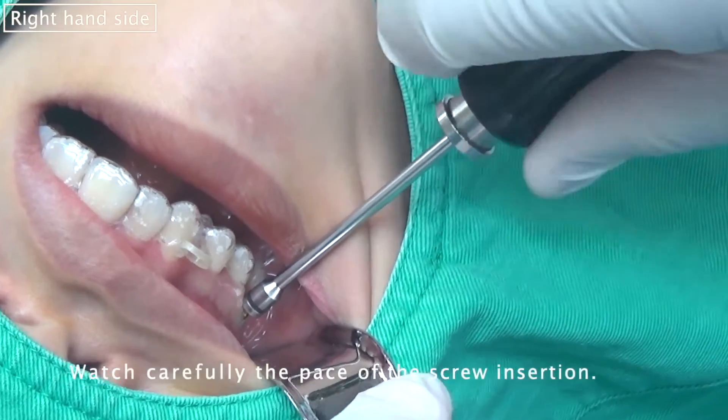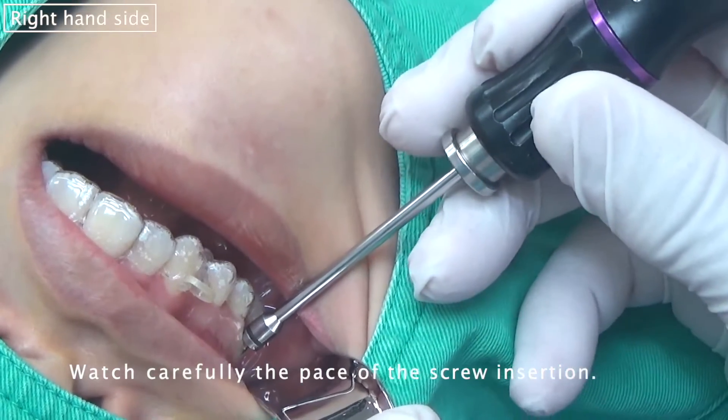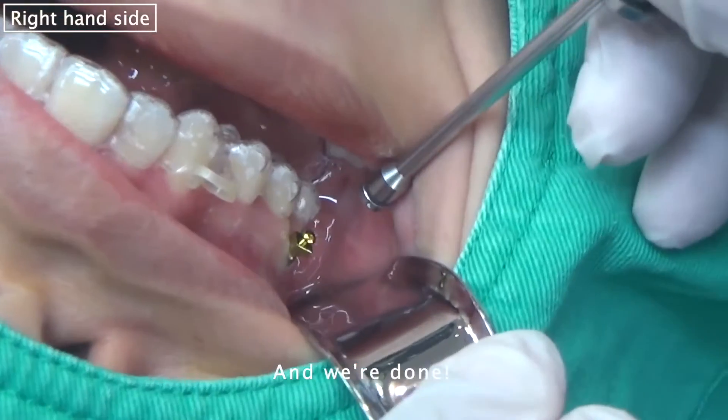Watch carefully the pace of the screw insertion. And we turn.